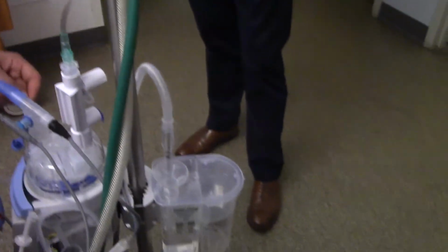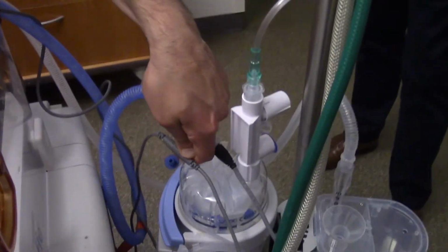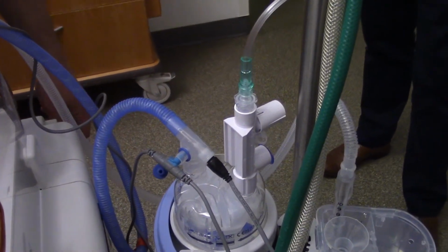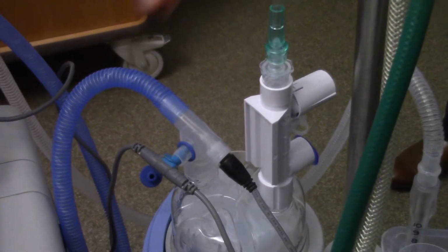It doesn't take much to stop that bubble. As you can hear, we've got a strong bubble. If this gets caught just a little bit, there's no more bubble, or very, very weak. And it doesn't even look like the temperature probe has come out.